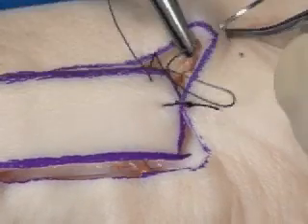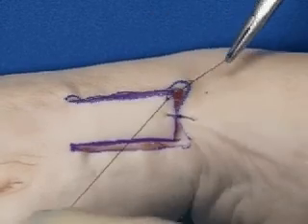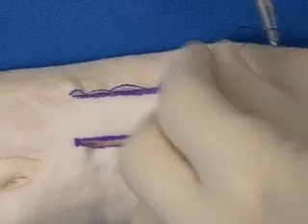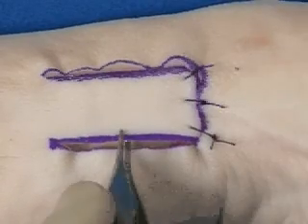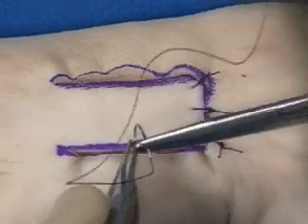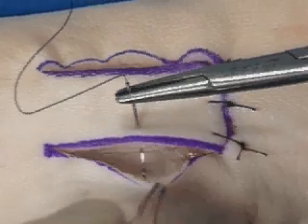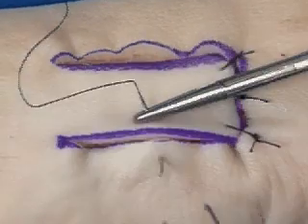The corner sutures are placed next, since they are the other primary sites of tension in this flap design. Here an instrument tie is being utilized for the corner stitch. Again, a surgeon's knot is put down on the first throw, and now we have a problem of unequal skin edge length. The skin edge is longer than the flap edge. We will then close this with the principles of halving.